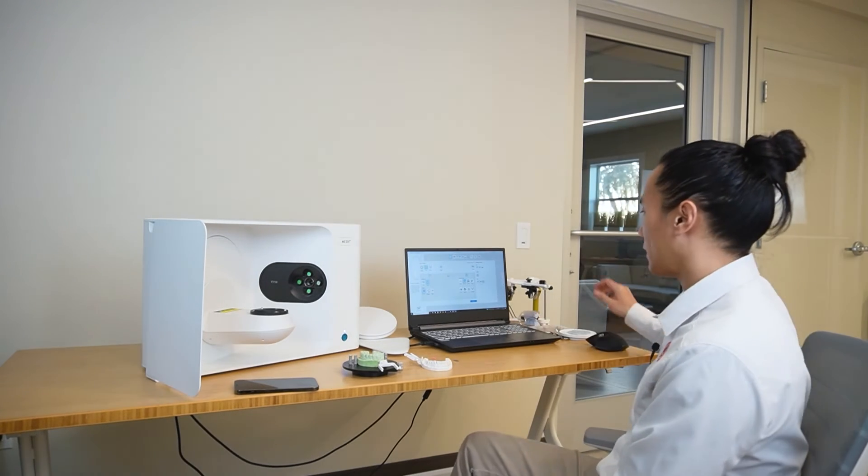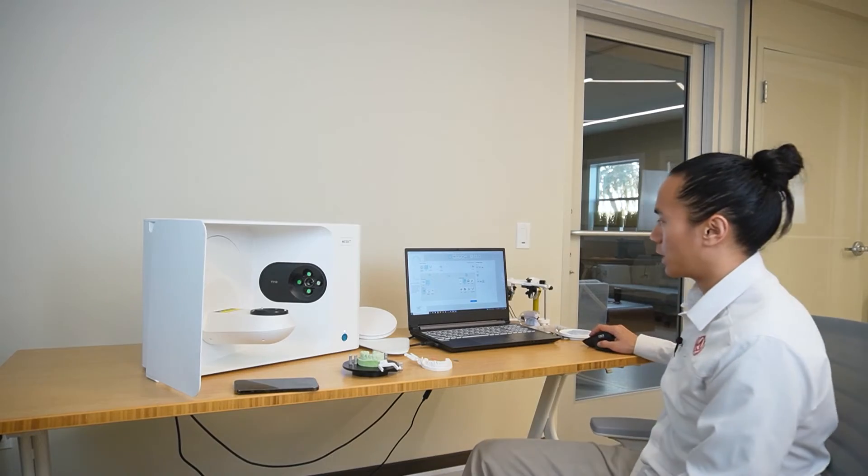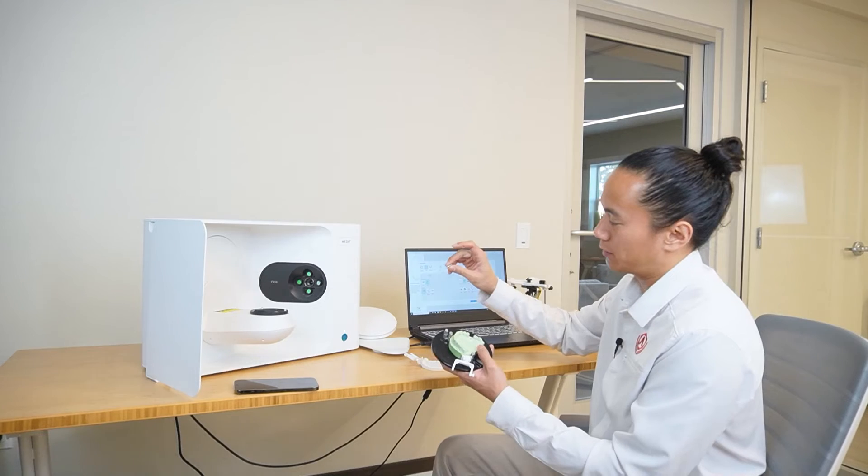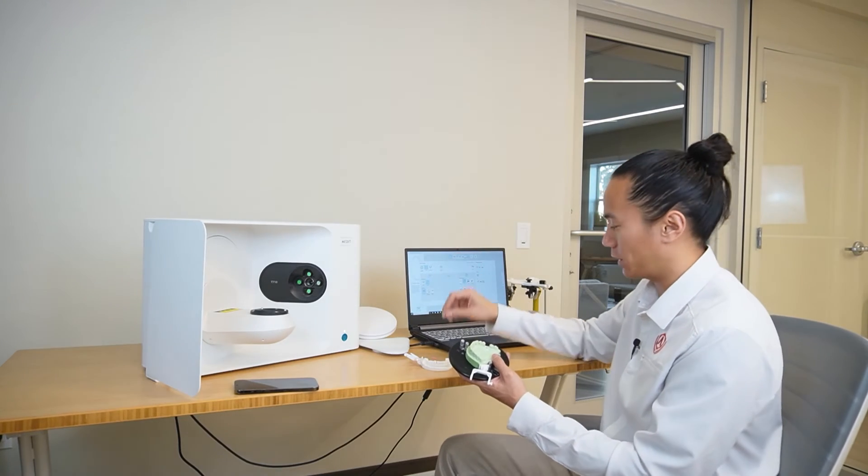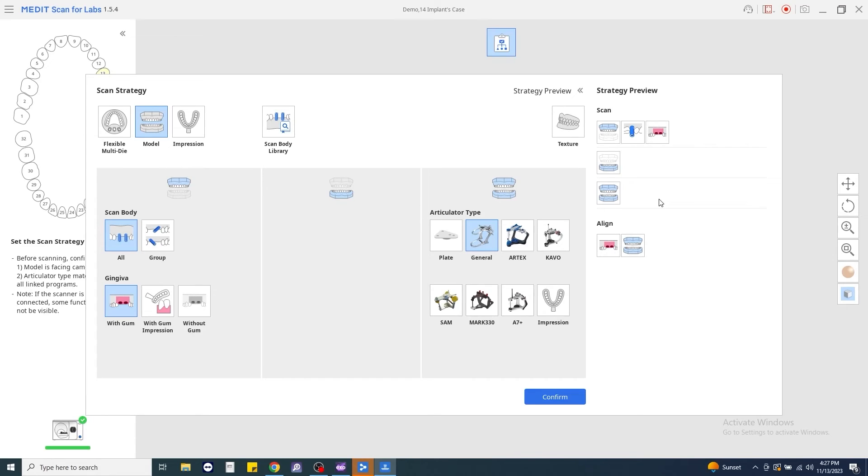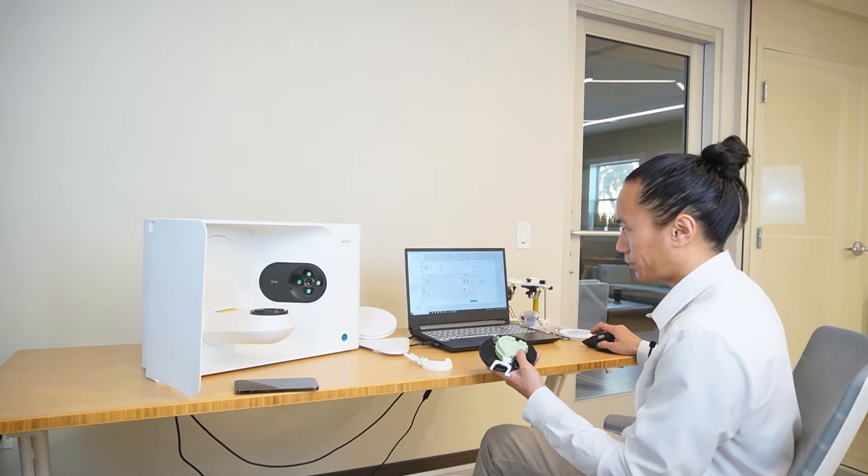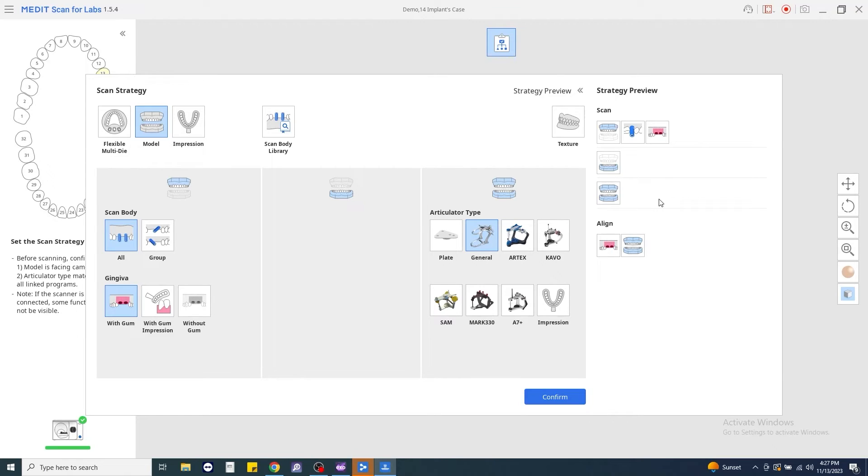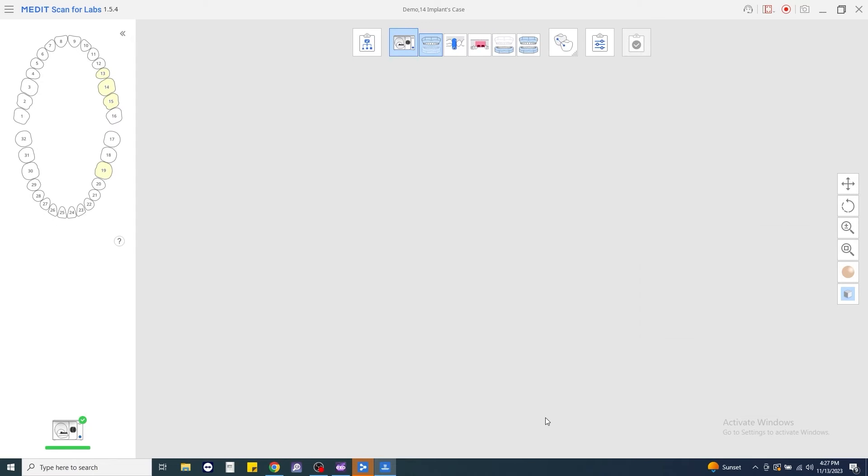Once the ExoCAD setup has been completed, we're going to confirm our scan strategy. So from here, what we're going to make sure of is that if we have the ability to scan our gingiva and our scan body separately, we're going to choose the group for scan body option. For gingiva, we're going to say with gum. For the opposing, we'll leave it at default and articulator type as general. We'll go ahead and confirm that.